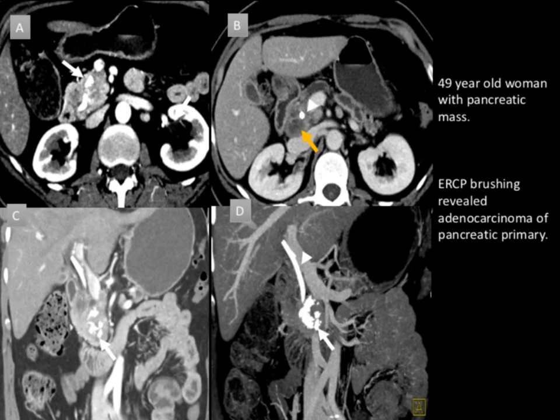Sometimes the way I diagnose a carcinoma arising in a patient with chronic pancreatitis is displacement or movement of the calcifications compared to prior studies.